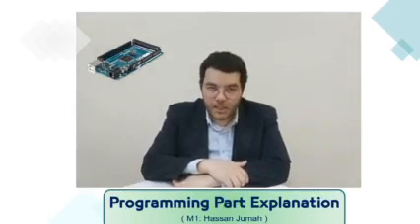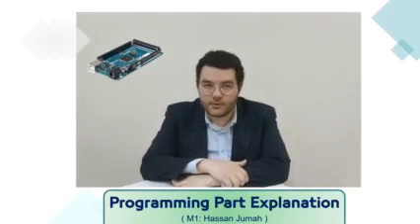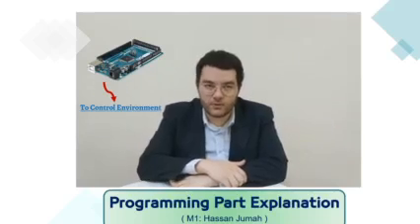We'll be using Arduino Mega as a microcontroller. It will take signals from input sensors to control the environment inside the incubator accordingly.